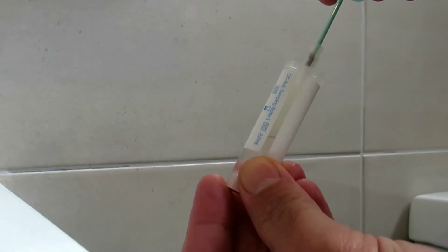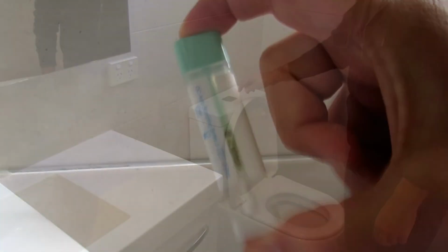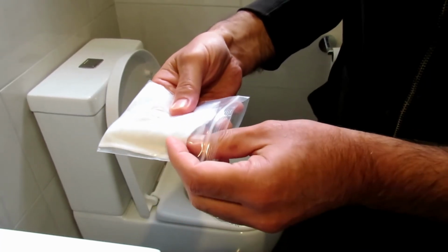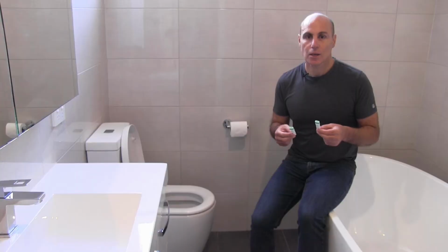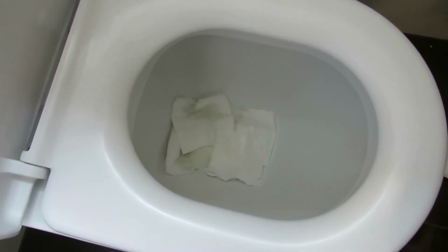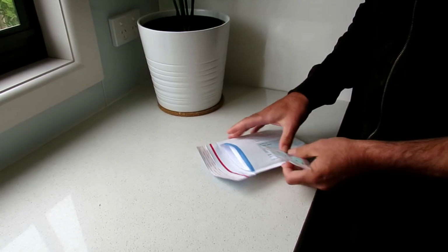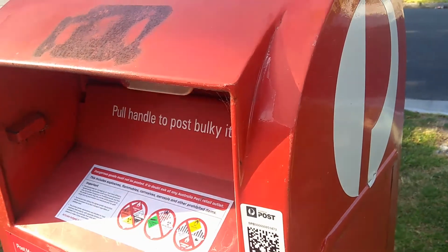You then put the stick back into the collection tube, click it shut, and give it a shake. When you're finished, just flush the toilet. The liners are biodegradable. You then put the collection tube into the padded Ziploc bag and place it in the fridge. You then repeat the process next time you need to go to the toilet so that you end up with 2 different samples from 2 different bowel movements. If for whatever reason a toilet liner ends up sinking, just use a heap of toilet paper. Works just as well. When you've collected 2 samples, fill out the forms and then send the samples and the forms to the lab in the reply paid envelope.